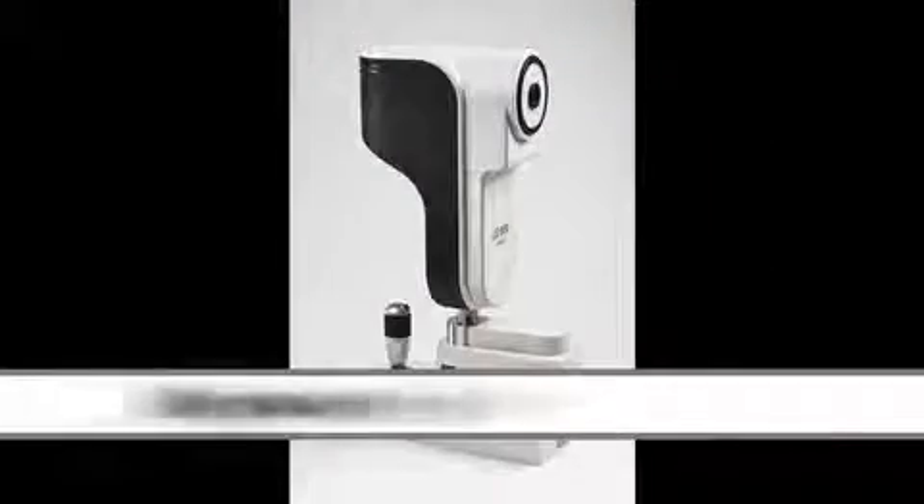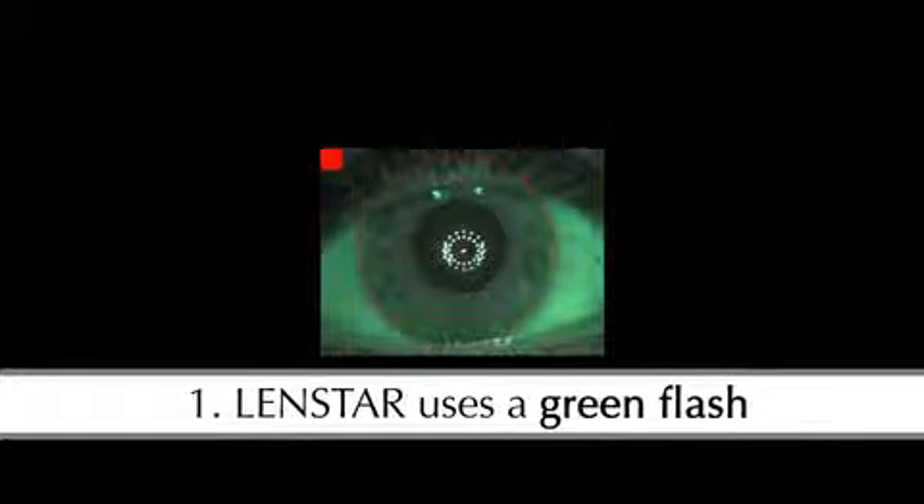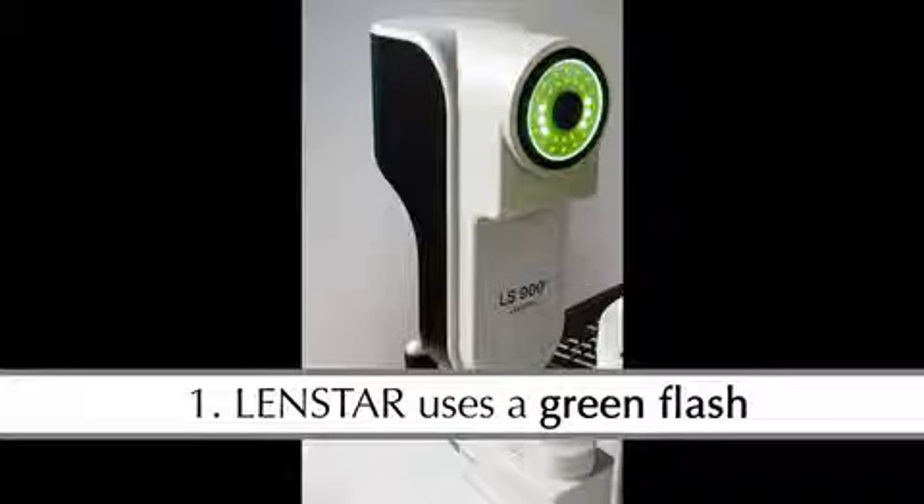Lenstar features three valuable improvements to the white to white measurement. First, the system uses a green flash. This provides a red-free image for maximum contrast and precise measurement.